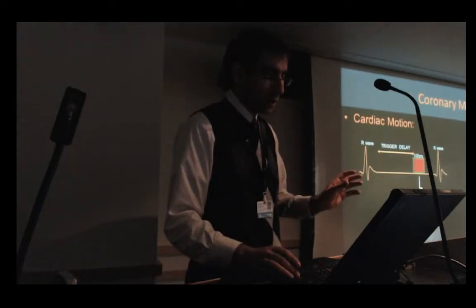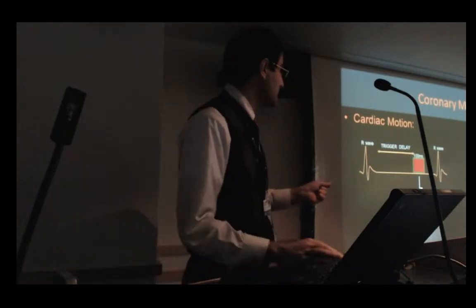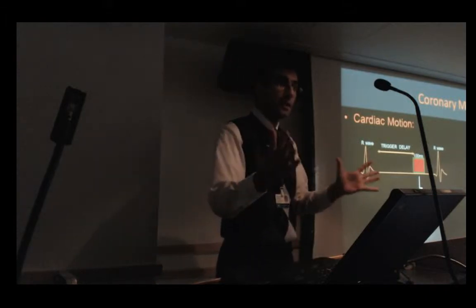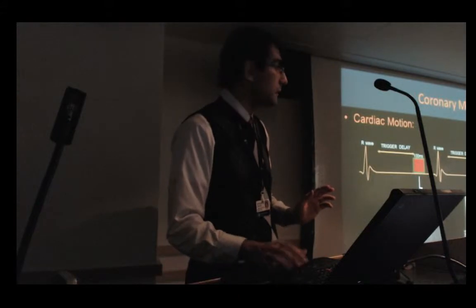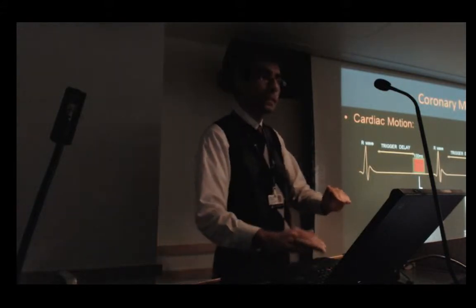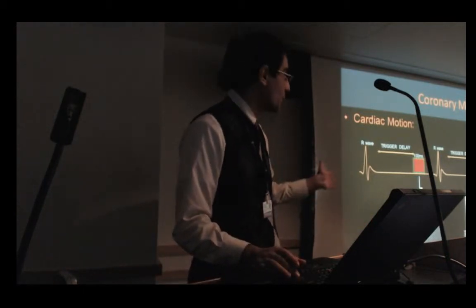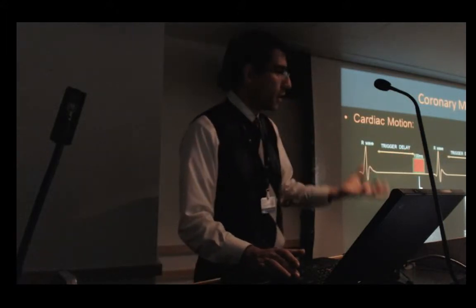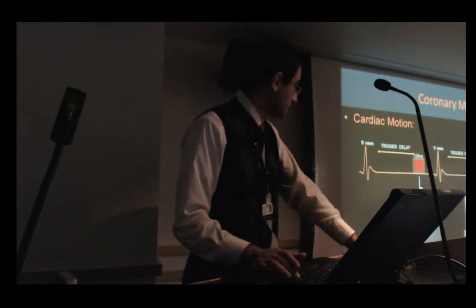And if my TR is 5 milliseconds, for example with an SSFP acquisition, that means I can only acquire 20 k-space lines during this time. I cannot fill up the whole k-space. So I have to wait for another cardiac cycle, and then acquire the rest of my k-space, another 20 lines. That even prolongs scan time, because I have to wait or average over time to acquire the whole k-space to have a high resolution image that is preferable for coronary artery disease.